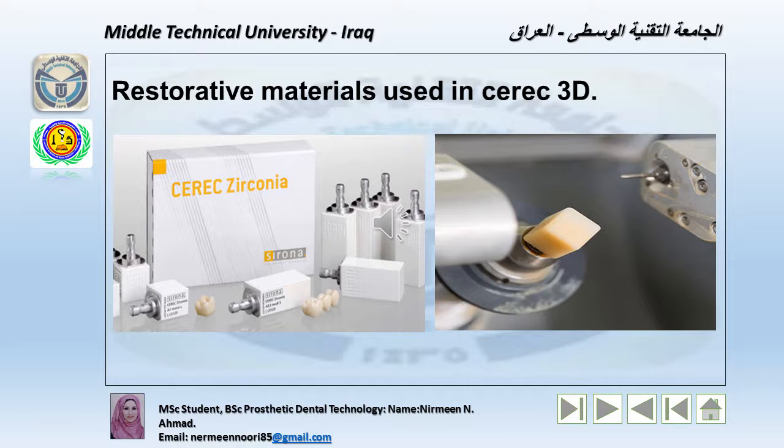Also, the restorative materials used in CEREC 3D are In-Ceram spinell, magnesium oxide, In-Ceram aluminum oxide, and In-Ceram zirconium oxide. The indication is anterior crown and bridge. Adhesive cement, self-cure: yes. Conventional cementation: yes.